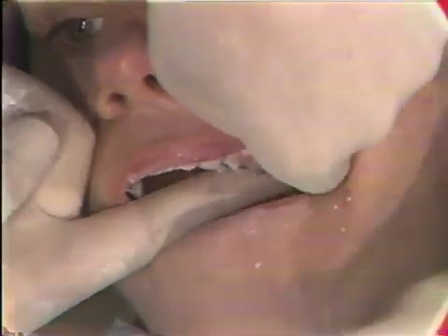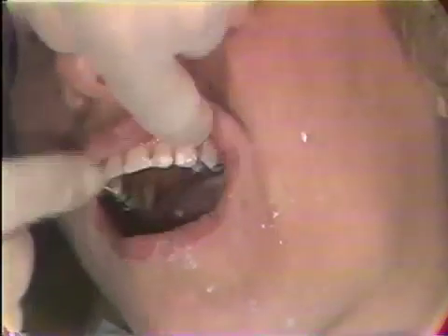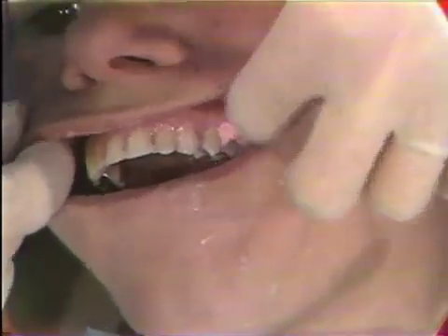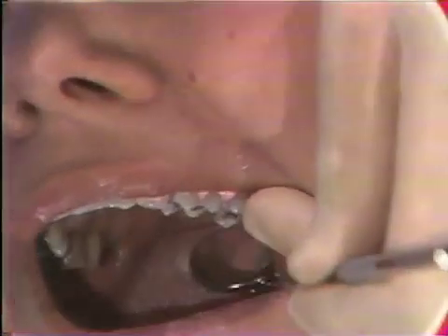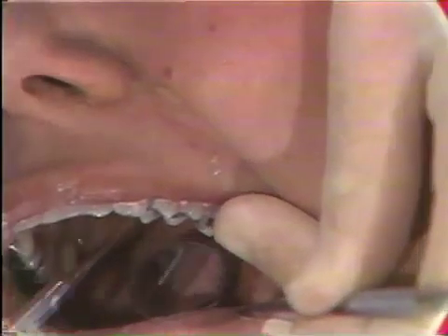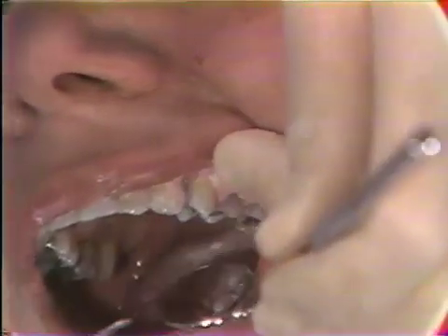A final smoothing of the dressing material is performed from both the buccal and lingual simultaneously to make sure it's acceptable. The dressing is always checked to see if the margins impinge on any muscle movement or movement of the soft tissues. The lingual is checked as well — the dressing should not extend too far onto the palate, as that would be something the tongue might unnecessarily play with.